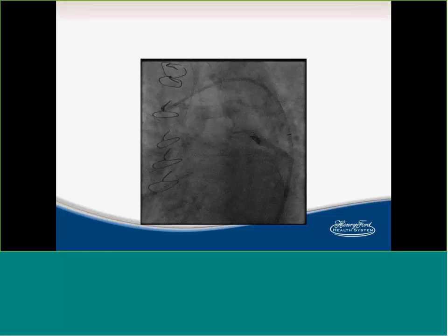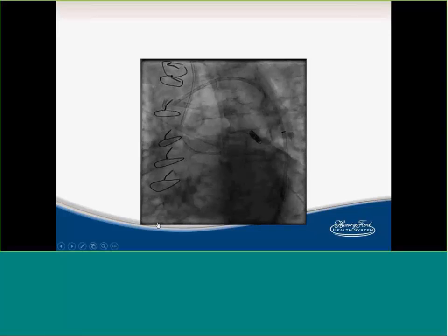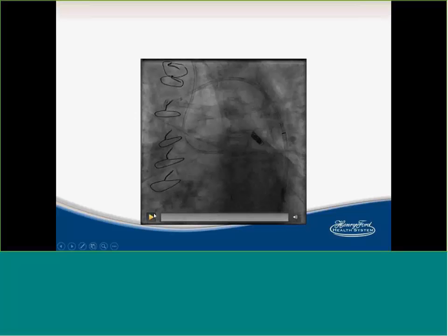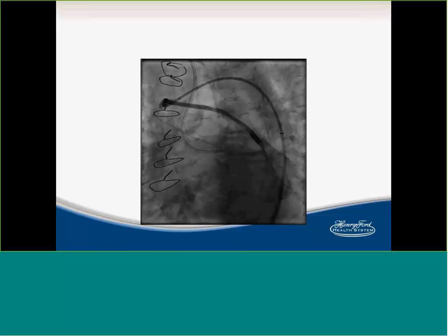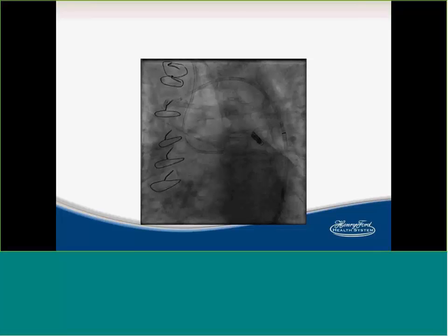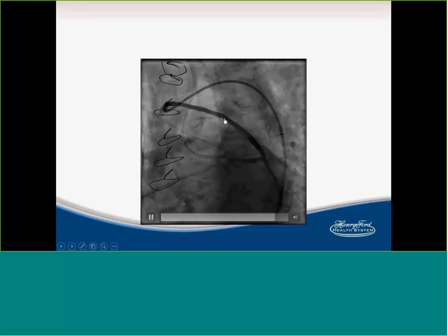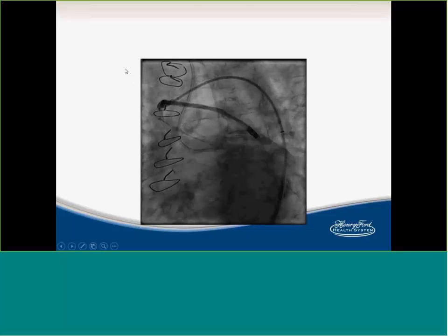just to ensure that this SVG is going to thrombose, because I was worried about competition with my native circulation and stent thrombosis. And I want you to watch this picture. The problem Aaron Grantham brought up is, if you have circulation going into the native and back out of the graft, and you have atherothrombotic material in that graft, like what you can see here, I want to bring your attention to this area, some haziness. You could actually embolize this outside the graft, and that could go to the brain.